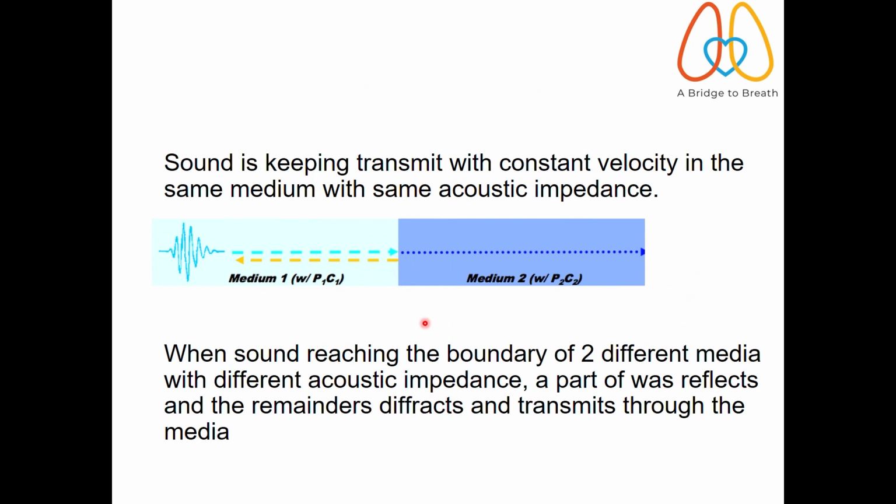Now, sound keeps transmitting with constant velocity throughout the same medium, but it loses energy as it passes through. When one medium and a second medium come together, that is a boundary, and at that time the reflection of the sound occurs.